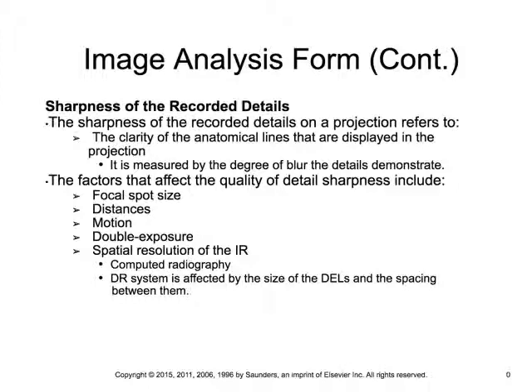Was there patient motion? Was it involuntary motion or voluntary motion? What would an example be of voluntary patient motion? Moving their arm, not listening to breathing instructions. What would be involuntary patient motion? Heartbeat, farts, right? Any kind of action within the digestive system.